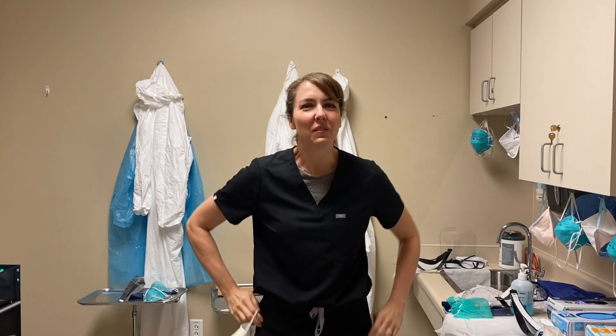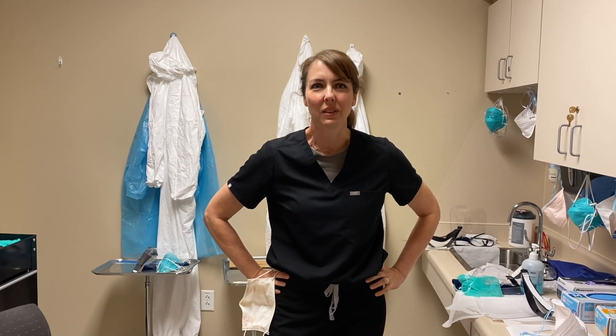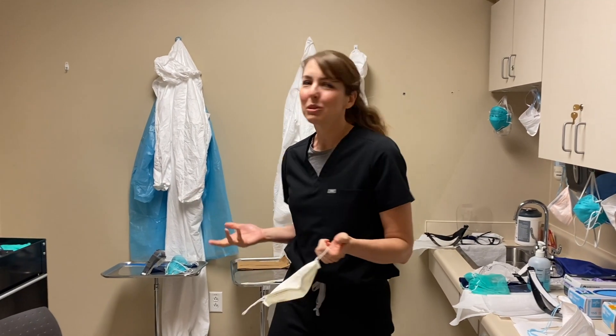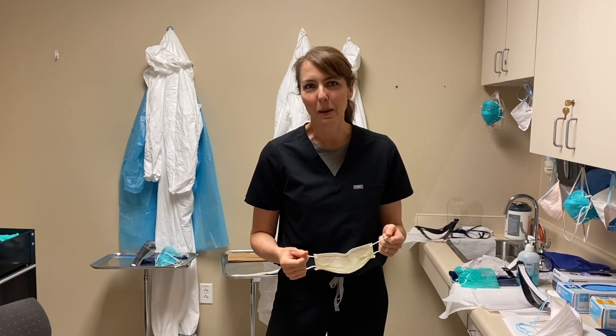Hi, on this edition of Your Health with Dr. Christie, I just want to go through putting on personal protective equipment and talk about some of the ways mistakes could be made. I'm about to go see a potential COVID-19 patient at the COVID-19 triage clinic that I've been working at this week. And of course, I wore my mask into the room. This is the room where we all get changed, and I just want to go through each step and talk about potential mistakes.